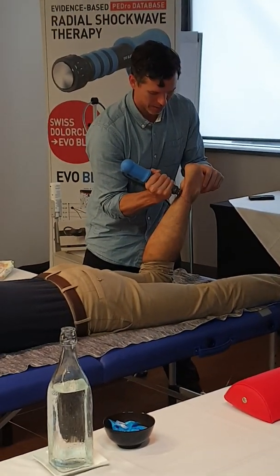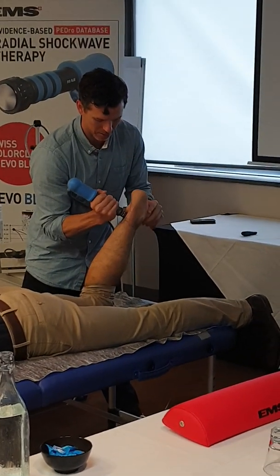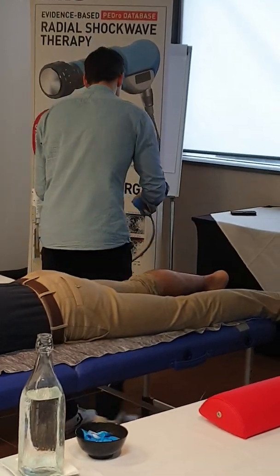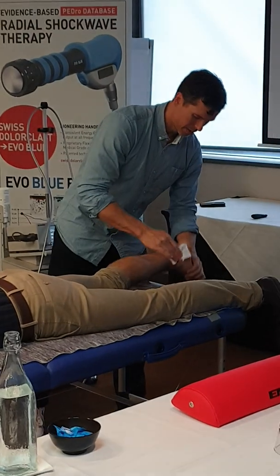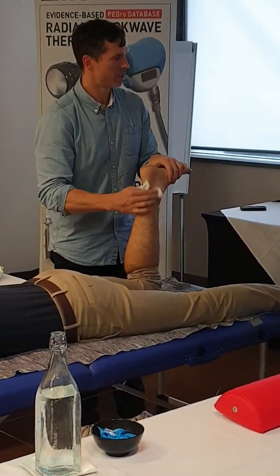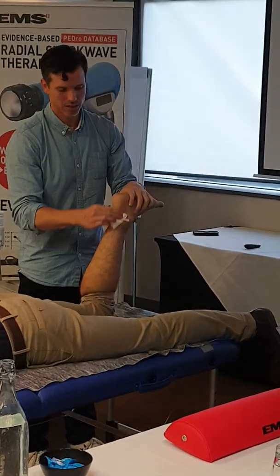A little bit there. Yeah, it's pretty good. Okay, hang on. Give me a wipe. Now, we should have tested you before. Again, I just do those four tests really: the knee against the wall, the Achilles.